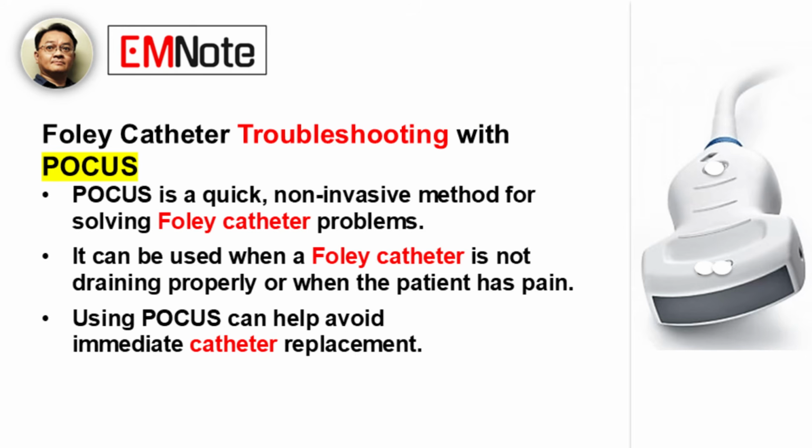Using POCUS in this way allows us to quickly pinpoint the problem, leading to a more targeted and effective intervention, saving time and reducing patient discomfort.